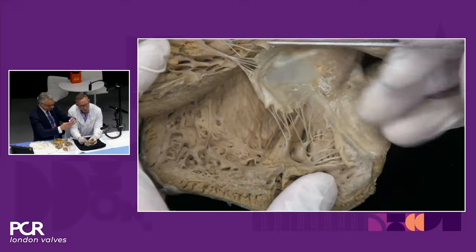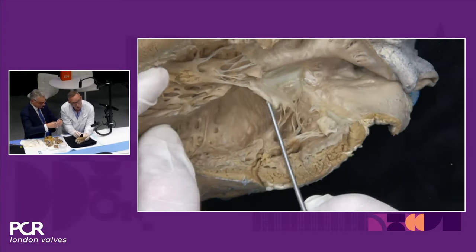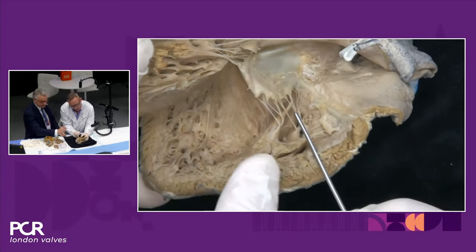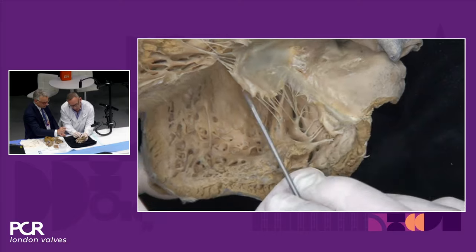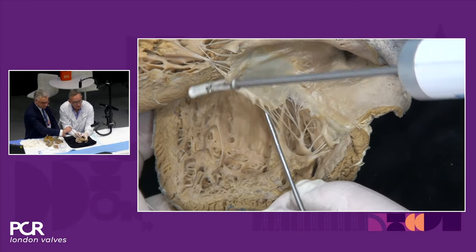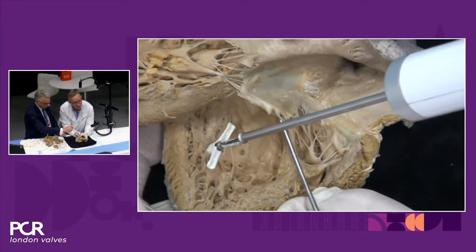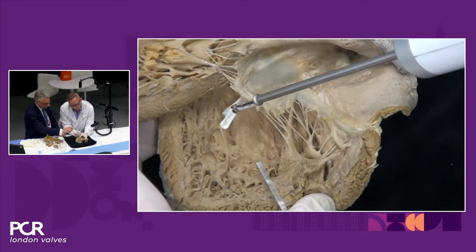So if you look at this region, the A2 region, you can see there's a bare area where there's no cords. You've got cords coming from either papillary muscle. But in this region here, if you put your clip in here, for example, then it's very easy, isn't it, to grasp that leaflet. You've got probably a good 5 millimeters or so where you could grasp.